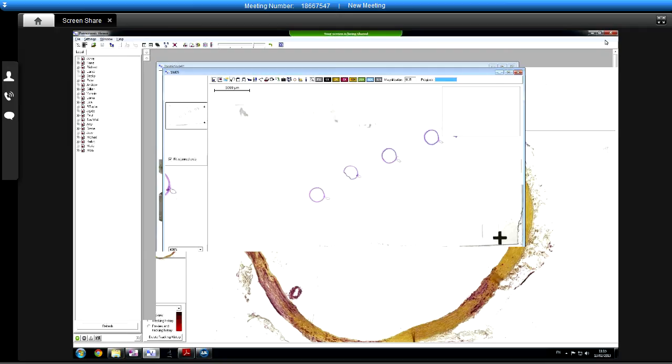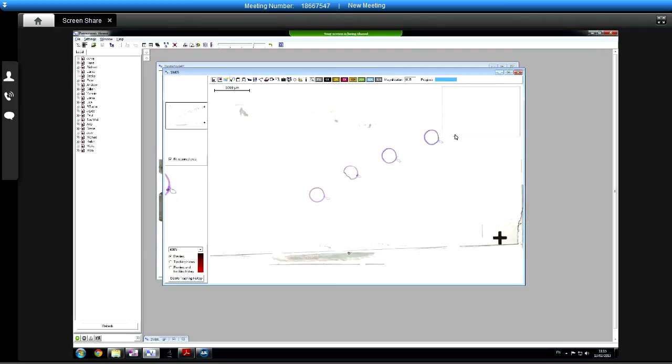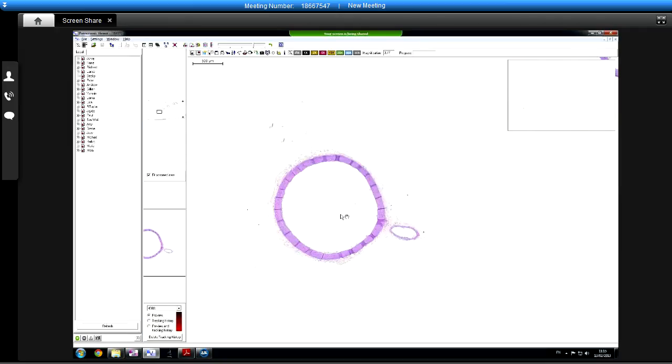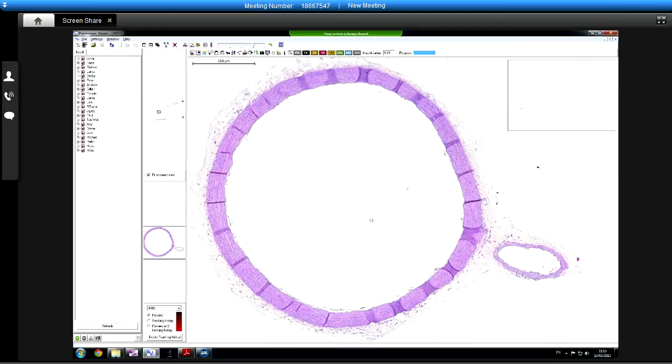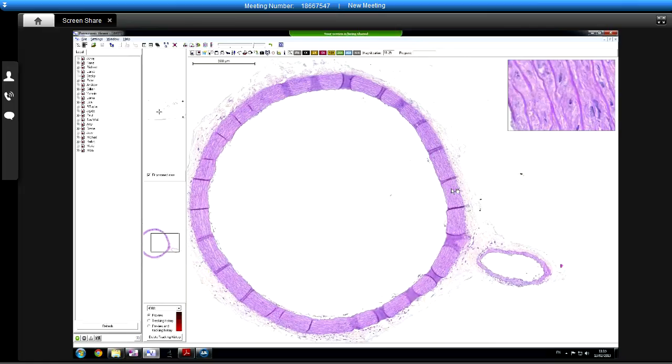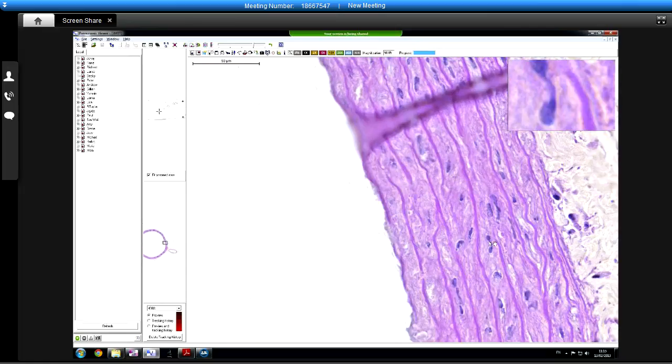This is just the nuclei, so it's probably pretty similar to. So this again, is it just how much pink within the total thing? So it's the nuclei. Oh right, sorry, let's have a look. Purple. Yeah. So it's what within the ring? How many of them are there? Yeah. Okay. That's fine.